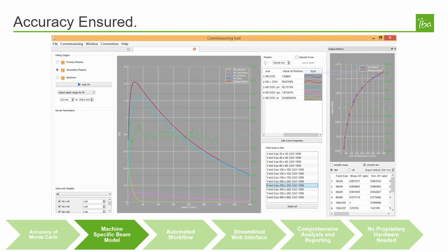This standalone service is a unique offering intended to provide peace of mind by independently reviewing the treatment planning system commissioning data model. Errors in beam data collection are reported to frequently lead to flawed treatment planning system beam models and thus to systematic dose computation errors, which are difficult to spot and to eliminate.